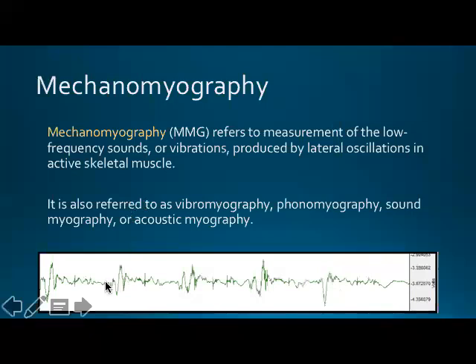So if you're cycling at 65 RPMs, you're constantly cycling through, and if we were going to analyze this, we would have a burst here. So this would be concentric action, then eccentric, where that muscle is not being activated. Another concentric burst, not activated, concentric burst. Noise from the movement, concentric burst. You'd have to know exactly, based on the cadence they're exercising at, where those concentric bursts would occur in order to pull out that signal.